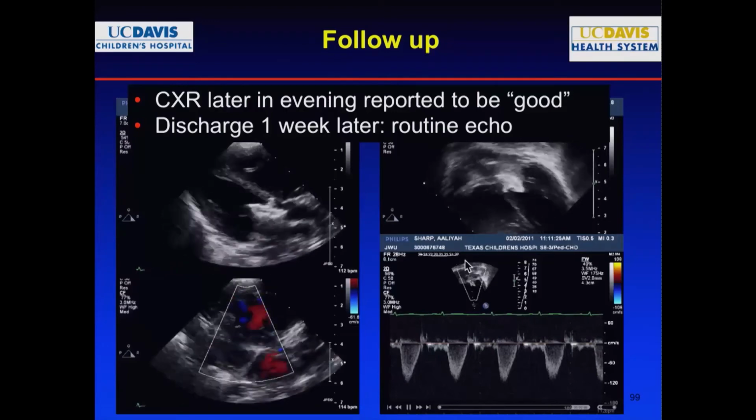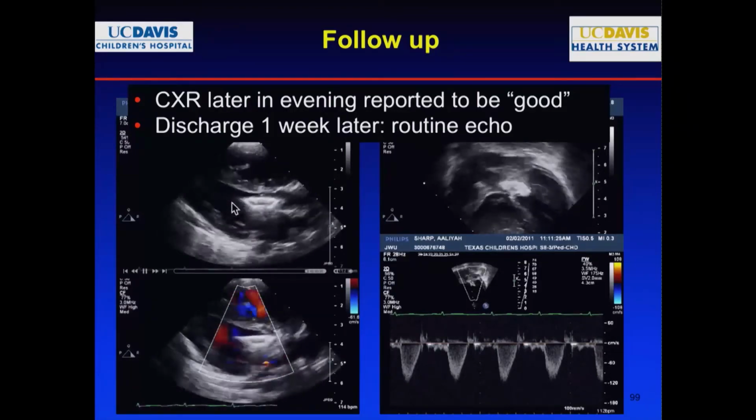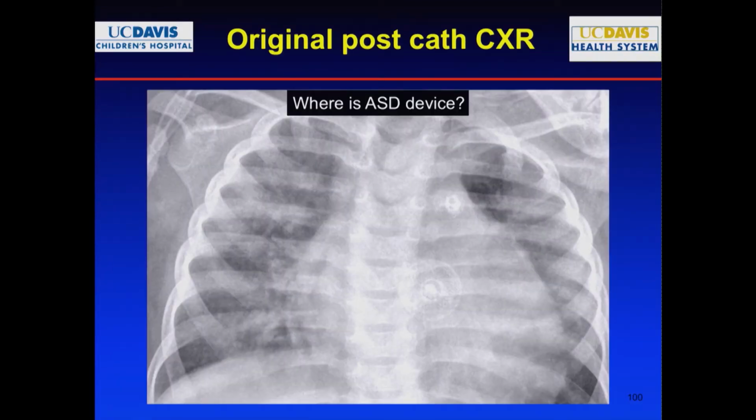The device had embolized, is sitting in the outflow tract. It's been sitting there for a week because nobody bothered to look at the x-ray because the fellow said it was good. So the lesson is, don't listen to your fellows.